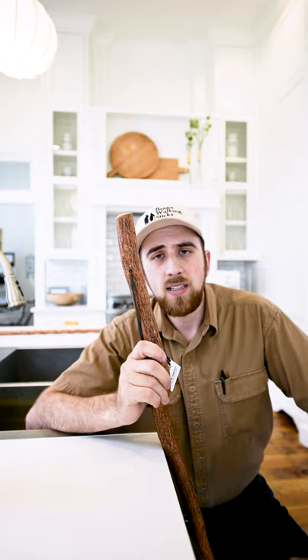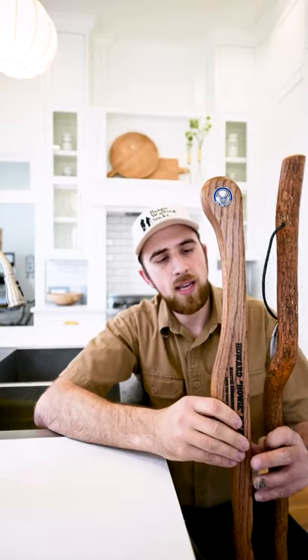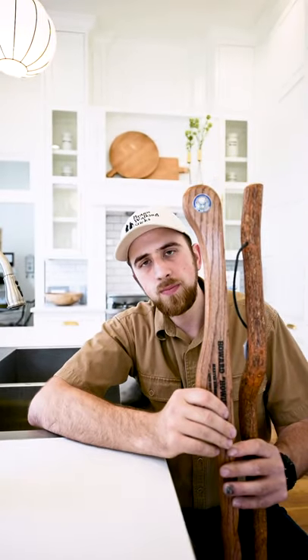This is a sassafras — this is a rustic stick — this is probably going to be the most difficult to sanitize because of crevices and such. I've also got a legacy staff. This is made out of oak lumber, so it is much smoother, much easier to clean.